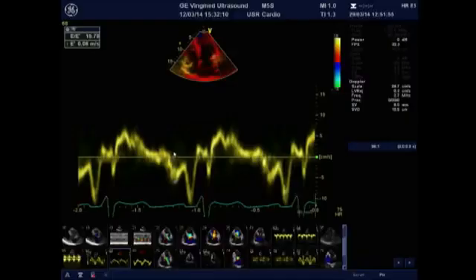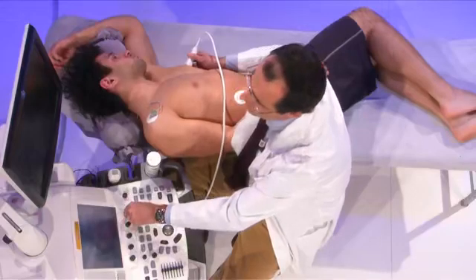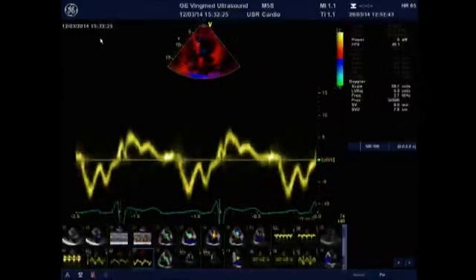When we move to Doppler myocardial imaging and you put the sample volume in the lateral site of the mitral annulus, we assess the early diastolic wave velocity, and we calculate the E/E prime, which is 19, almost 20. According to the ACVI guidelines, this ratio in hypertrophic cardiomyopathy suggests high left ventricular filling pressures if higher than 12. In this patient, this pattern clearly points to high ventricular filling pressures. This is just an example in the septum of this patient that the systolic velocity is low, and of course diastolic velocities are also low in this patient.